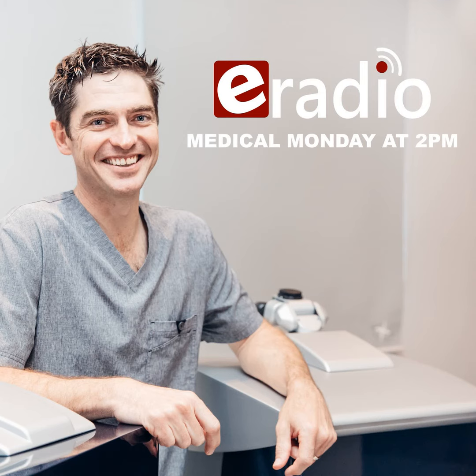But then we get to therapeutics. Now, therapeutics is a massive discussion on its own. People thought that, well, if they've got a scarred cornea, they've had a foreign body, or they had an injury to the cornea which has changed the shape, or they've had something that has scarred the cornea, even an infection. We can measure the depth of those scars now, and we can use the laser to remove the scar, and sometimes to reshape the cornea to get the optical shape of that cornea better, to try and improve your vision.